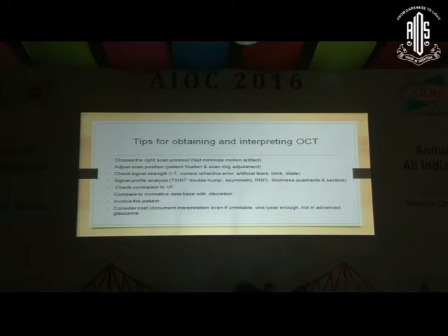Remember, your normative database is not very large. It usually varies from 300 to 500 patients. In fact, in the Stratus, you only have 3 Indian patients out of the 328 patients mapped. So use the normative database with discretion. Use your own diagnostic thinking along with the clinical picture.